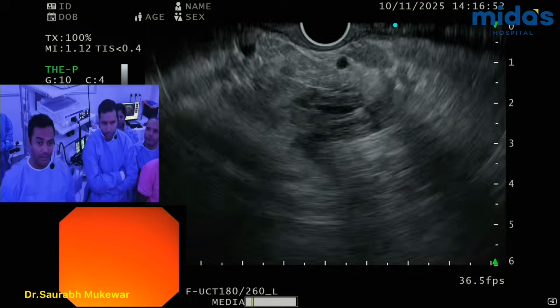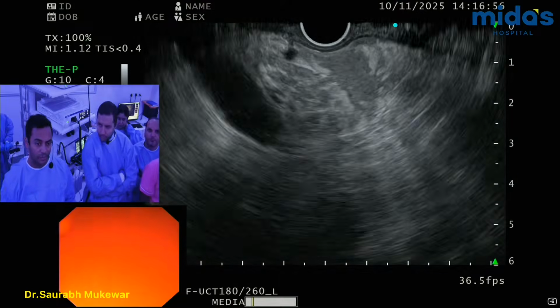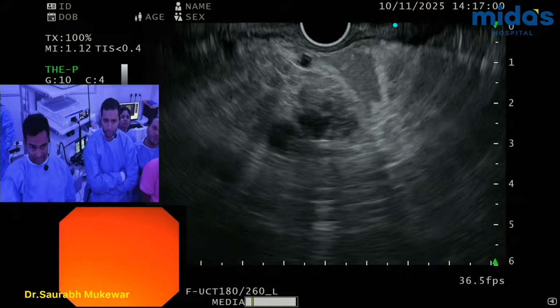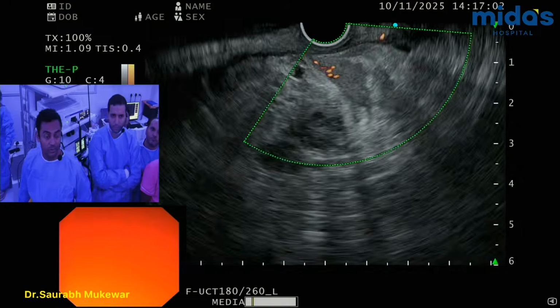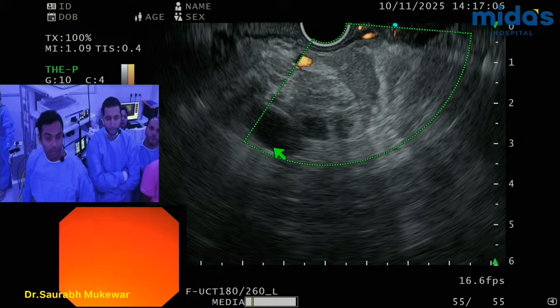Yeah, now the thing is, obviously, in India, you have to keep using them again. So that's why the yield is less. You have to use sometimes more. In fact, I hit a vessel, I think. So there's a little bit of a blood clot here. See there? So this is a blood clot here.